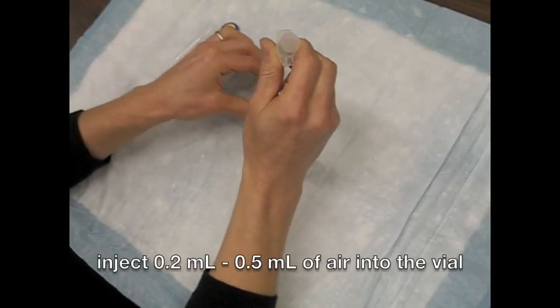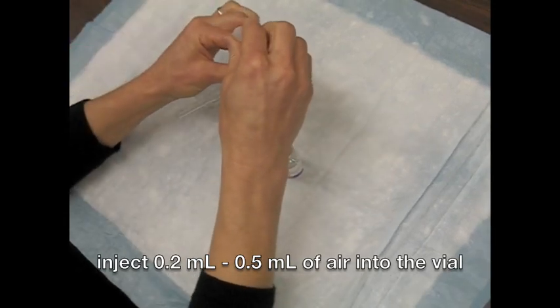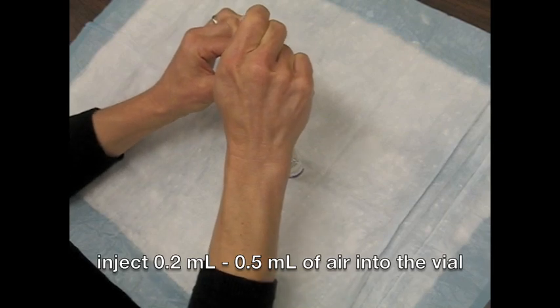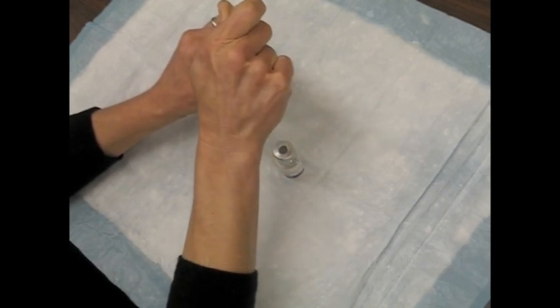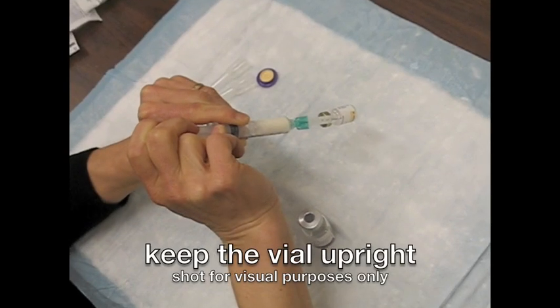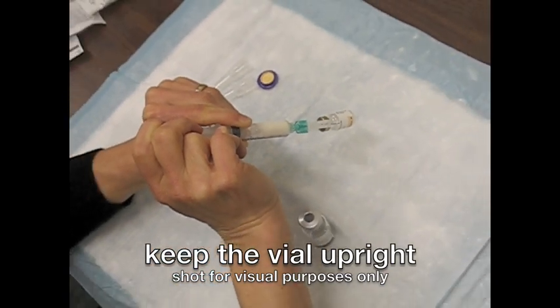For the first step of reconstitution or mixing, inject the 20 to 21 gauge needle into the vial containing the adjuvant. Injecting 0.2 to 0.5 milliliters of air can help with withdrawal of the adjuvant. Keep the vial upright. All of the adjuvant, even if it is more than 2.5 milliliters, should be injected into the antigen vial.